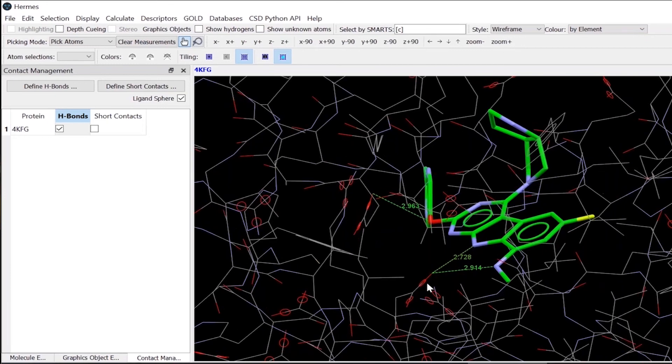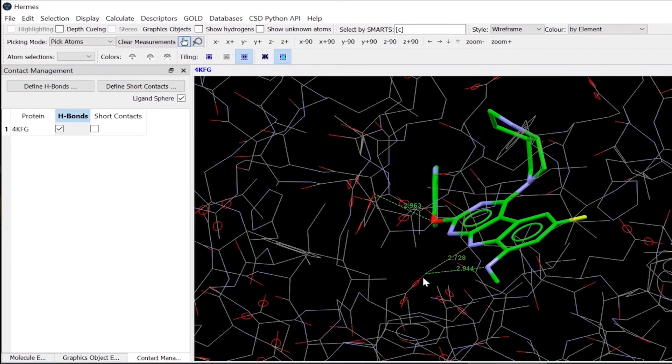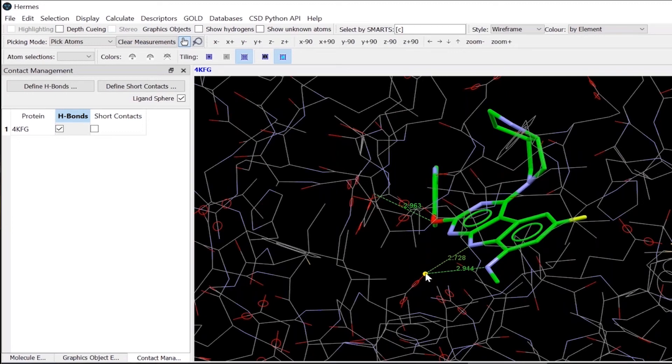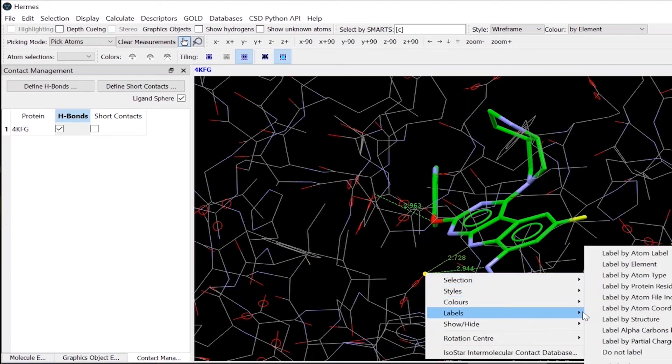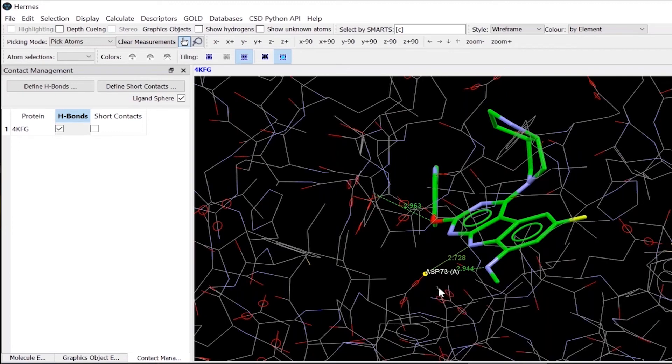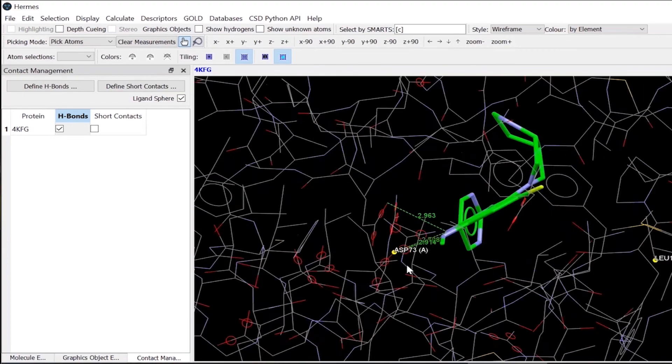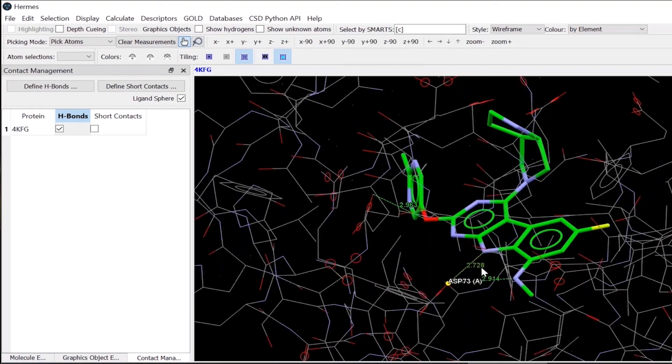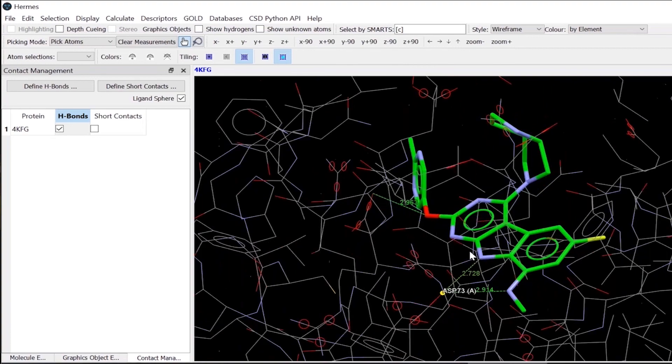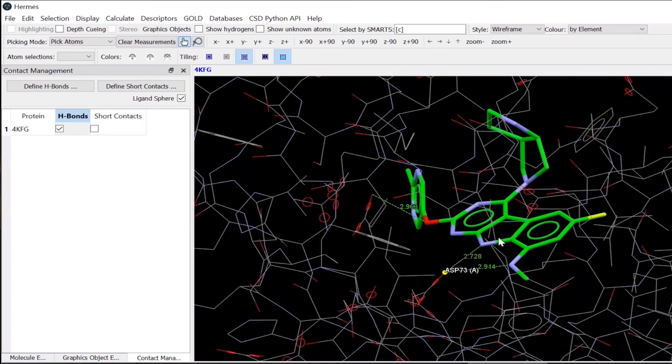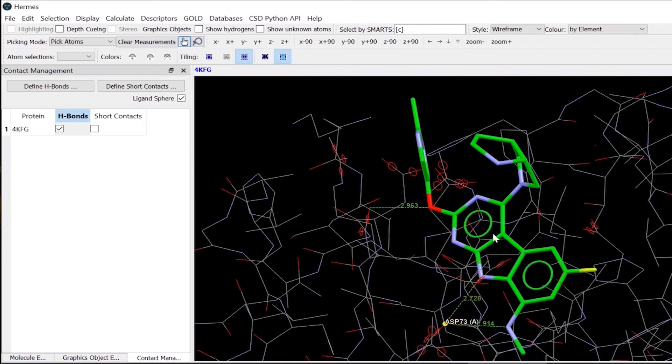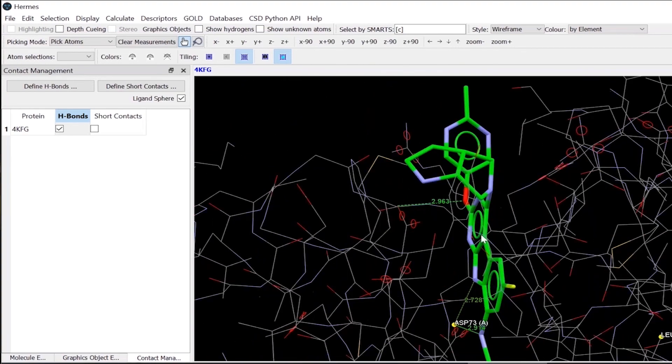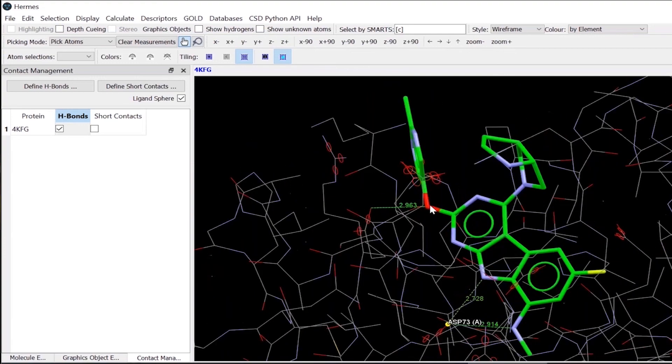For example, I can see here with an oxygen atom, if we want to find out which protein atom that is, I can also do that by enabling the label. So I can find out that the aspartate 73 is creating some interactions with this ligand molecule. So in this way, you can measure your own distances and angles and torsions around the binding site and analyze the binding site properly.